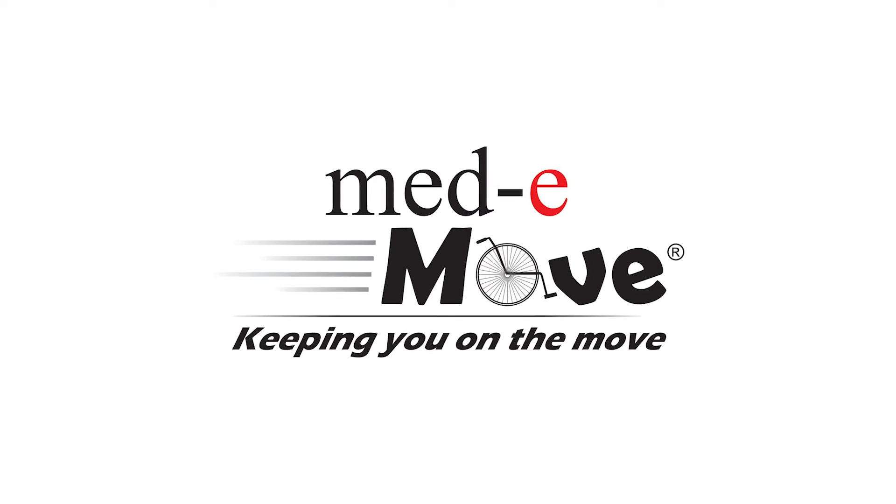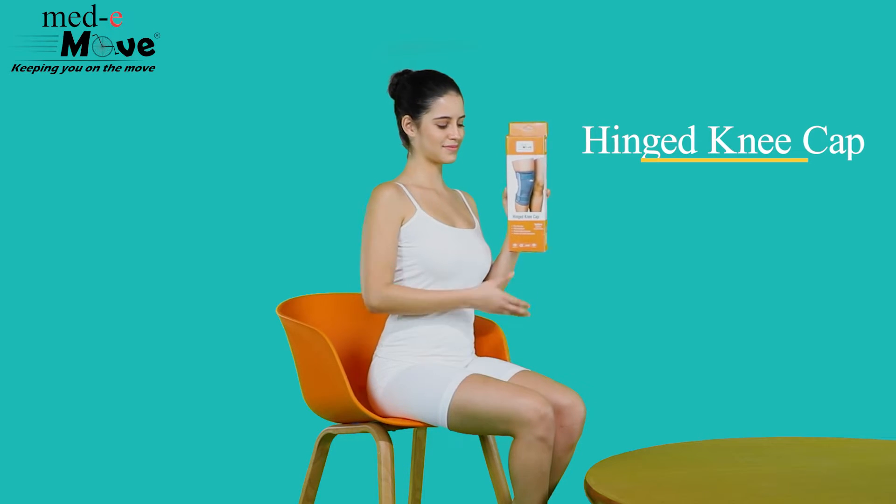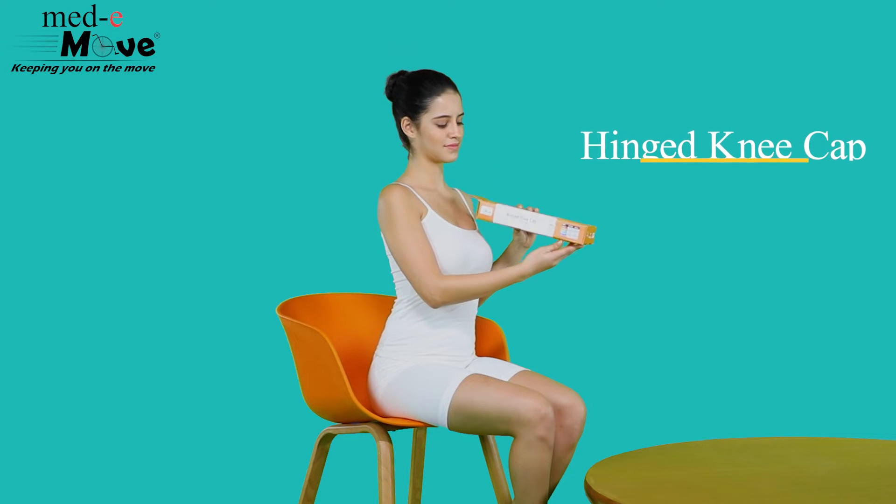Medimove, keeping you on the move. Here we will demonstrate how to measure the size and wear the Medimove hinged kneecap.